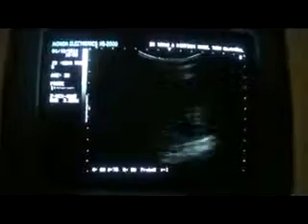And I did not see the right kidney in any other ectopic location, so it's absent congenitally.